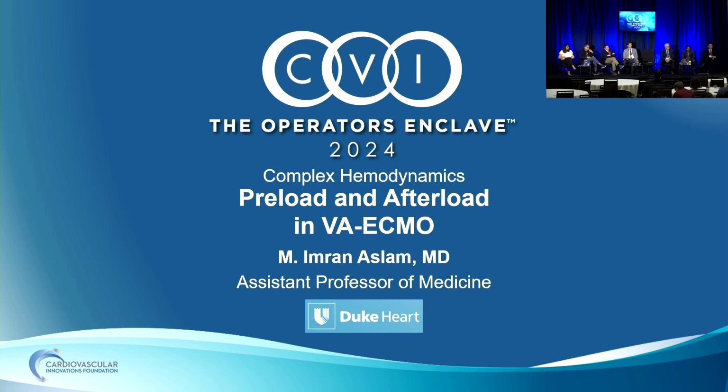very reasonable. Again, I think the reticence was just putting more stuff in a patient, right? Putting in ECMO, et cetera, when if you could have gotten away with an Impella CP, maybe that would have been enough. So I think this is just comfort of the institution, comfort of the operator in this situation. But in retrospect, that would also have been very reasonable to do.